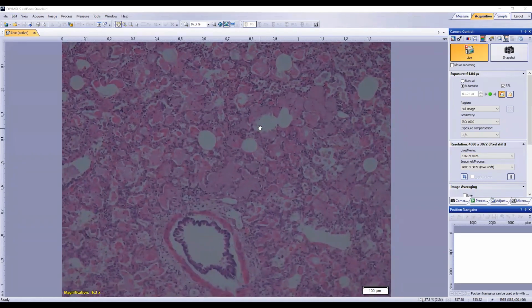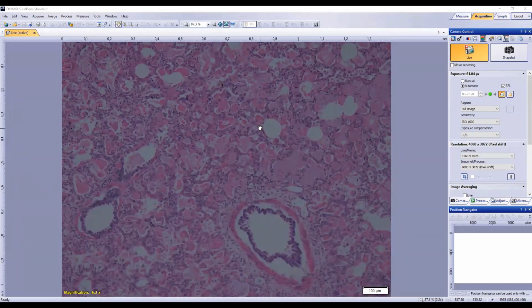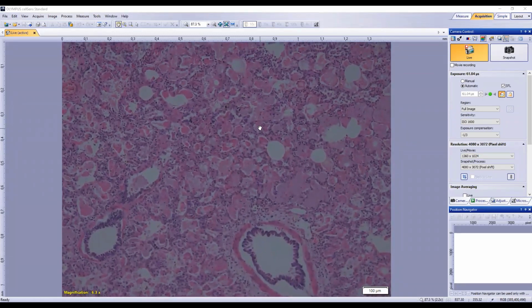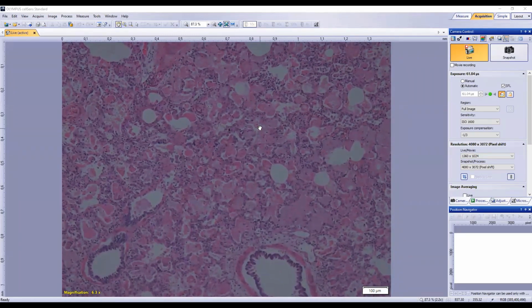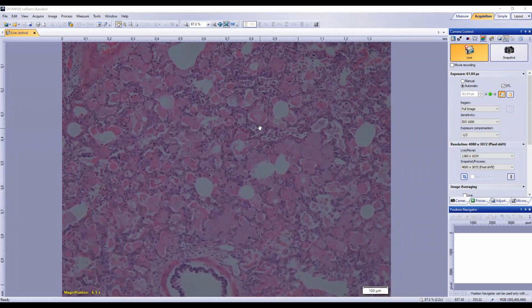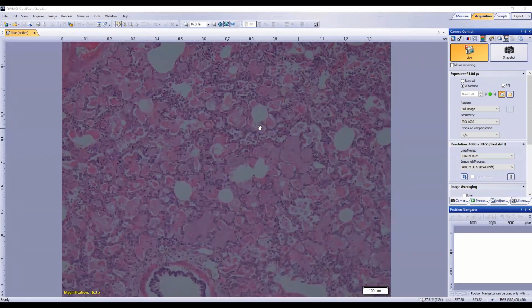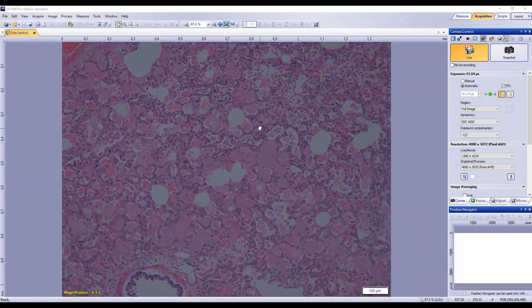So if it's still edema, I certainly use high protein edema when it's more hyaline like that and appears more fluid than solid. But fibrin I would reserve for when it's actually undergone that change and polymerized and started to clump and become more chunky, if I'm using a very bad descriptive term.